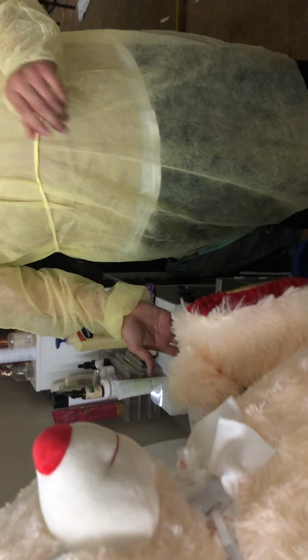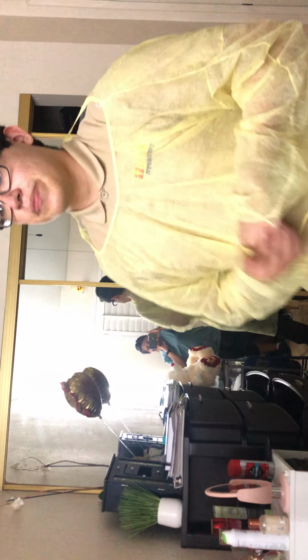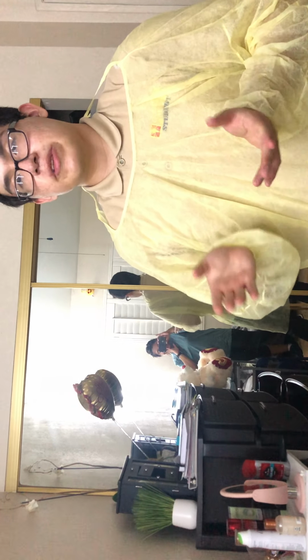After all my PPE is gone, I'm going to go ahead and document the dressing change I made, and document the stoma's quality, if there's infection, if there's any skin breakdown, his oxygen, how he tolerated the procedure. Give him the call light, give him the safety rails, lower the bed, put him in high Fowler's, and document the types of secretions that were present, if any. I will date, time, initial it, and that will be it. Skills complete. All right, thank you.